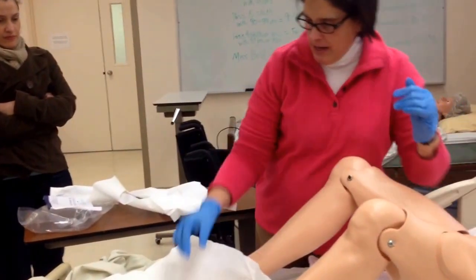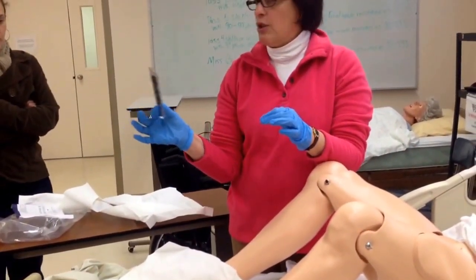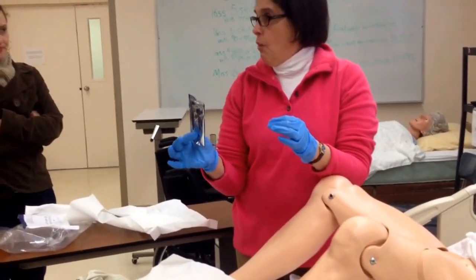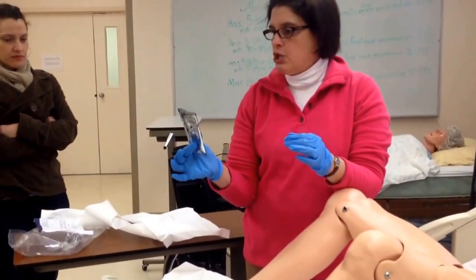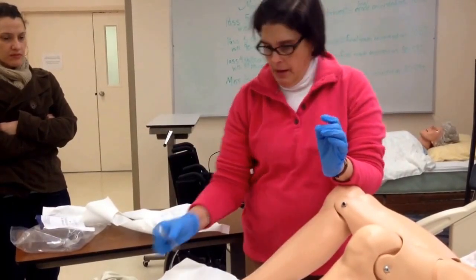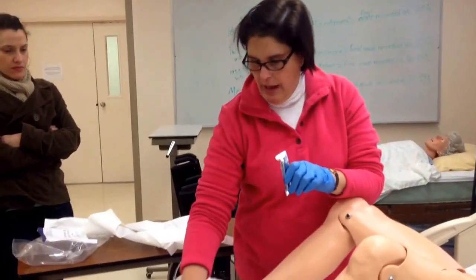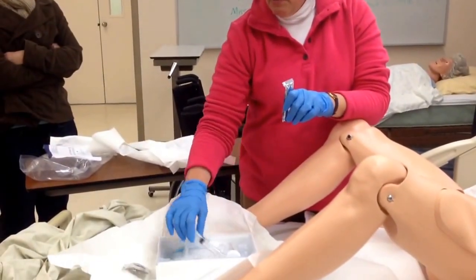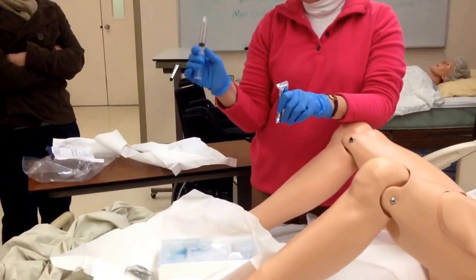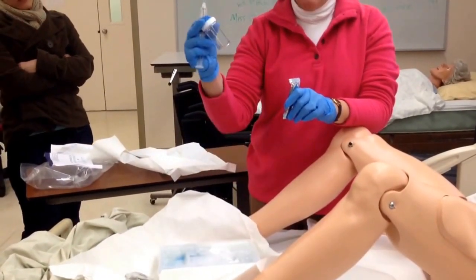Okay, so next I have povidone iodine sticks, or you may have other antiseptic wipes. Okay, so we're not going to do these on the mannequins. You'll just tell me, okay? And then you'll have lubricant, and you'll have your saline syringe to fill the balloon, okay? And then you'll have a container if you need to capture a urine sample, okay?